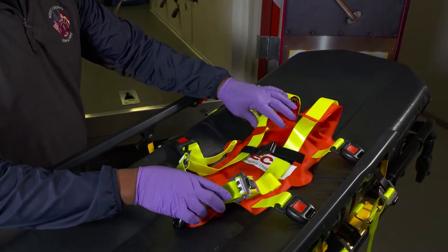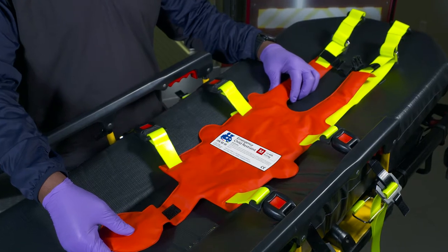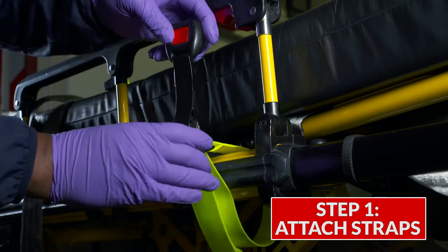The emergency child restraint unfolds easily and fitting it to your patient can be accomplished in six simple and quick steps. Attach two cot straps on each side of the cot frame runner rail and pull the buckle through the metal ring.